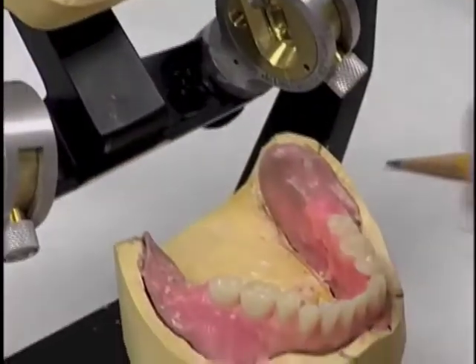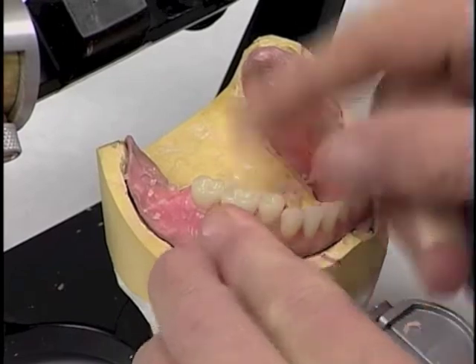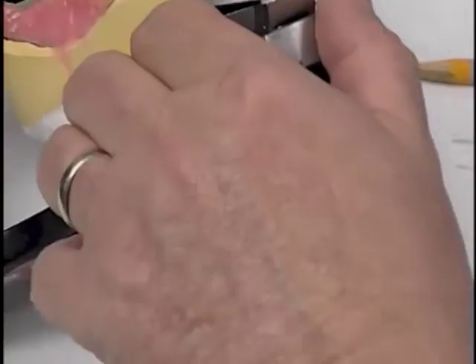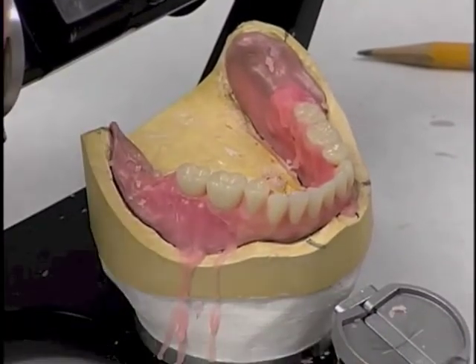And it seems that that's in very good shape, except it's a little twisted, and so I'm going to readjust both molars just a little bit, to keep from having that twisted look to them. And now that appears to be in good shape as far as the occlusal plane and all is concerned.